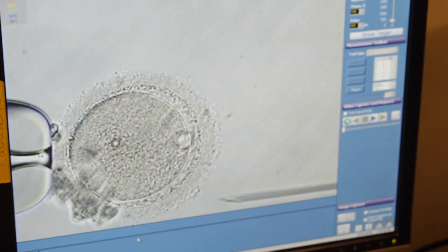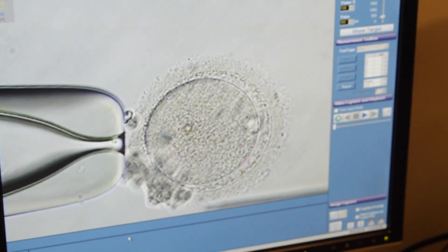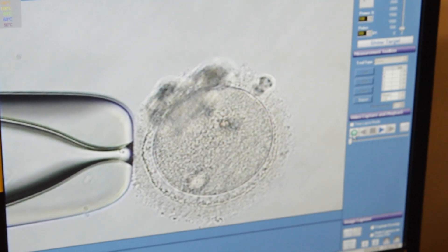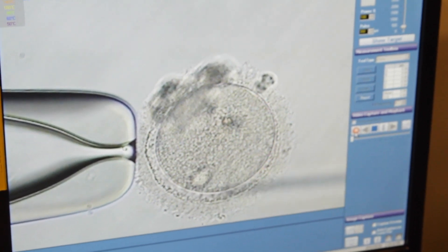Orientation of the oocyte on the holding pipette is very important. Data within our lab has shown that we get the best results when holding the polar body at a seven o'clock position.